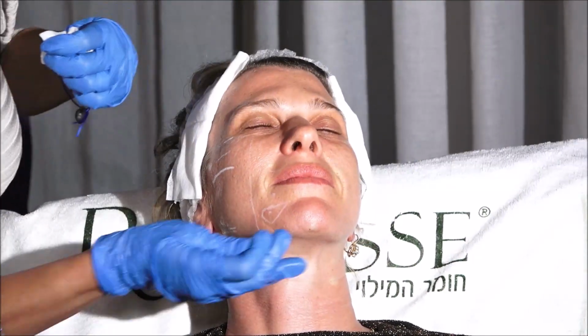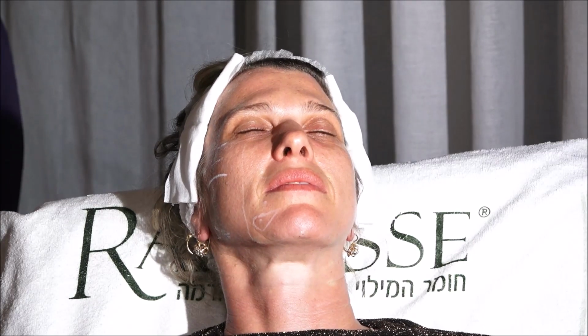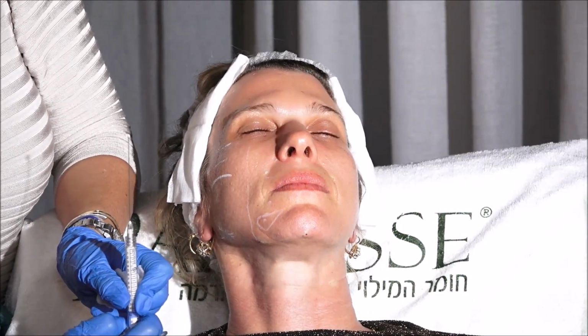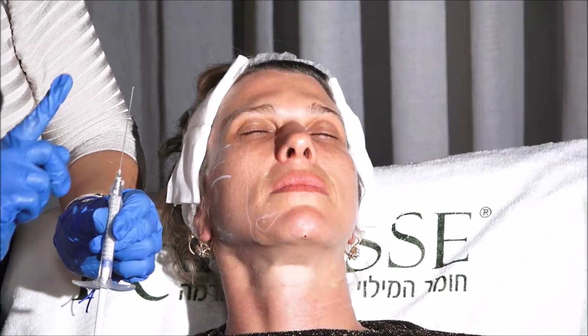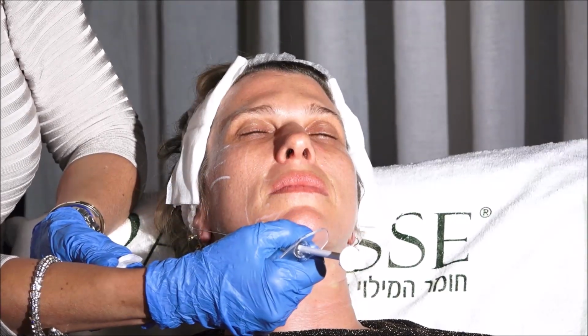I numbed already the points of entrance. So this is Radiesse Plus, don't touch the cannula, and I'm using a 22 gauge 70 millimeter because I need to get back here.